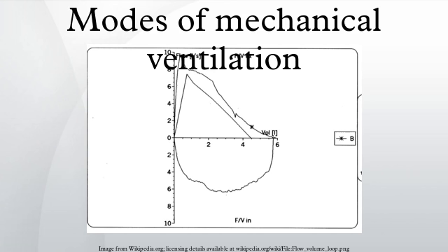Intermittent mandatory ventilation. Intermittent mandatory ventilation is similar to continuous mandatory ventilation in two ways. The minute ventilation is determined, and the patient is able to increase the minute ventilation. However, IMV differs from continuous mandatory ventilation in the way that the minute ventilation is increased. To be specific, patients increase the minute ventilation by spontaneous breathing rather than patient-initiated ventilator breaths. The ventilator breaths are synchronized with patient inspiratory effort.